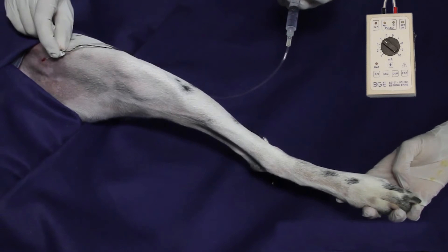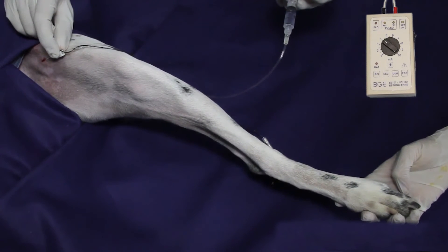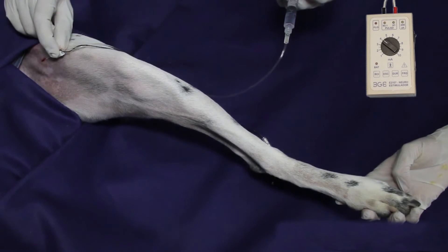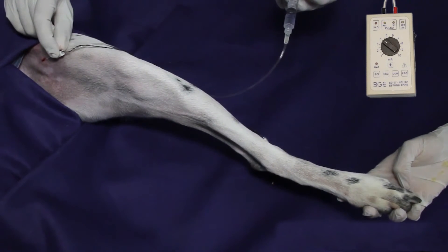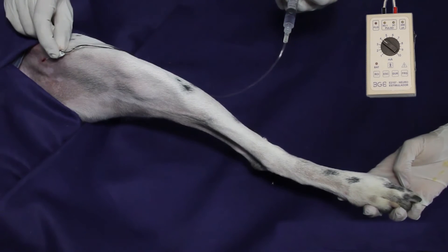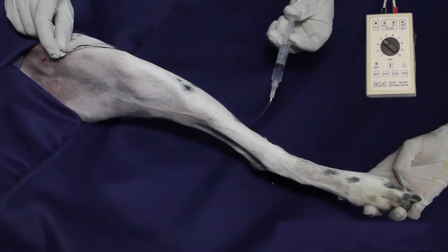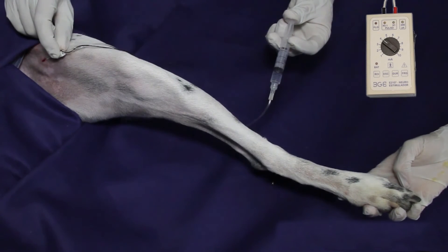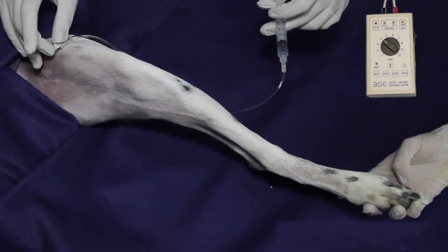The sciatic and femoral nerve blocks are usually used in combination. These blocks are indicated for anesthesia distal to the distal femur and are widely used for orthopedic procedures involving the stifle or distal to this joint.